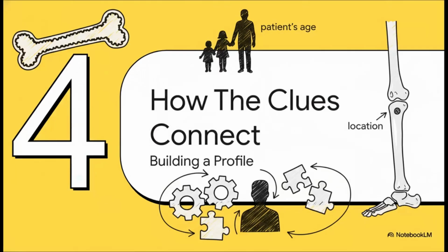Pretty cool, right? Okay, so now we've gathered all these individual clues: the border, the patient's age, the bone's reaction, and the location. The final step, and this is the real detective work, is putting them all together to see how these different pieces of evidence connect and build a complete profile of our suspect.